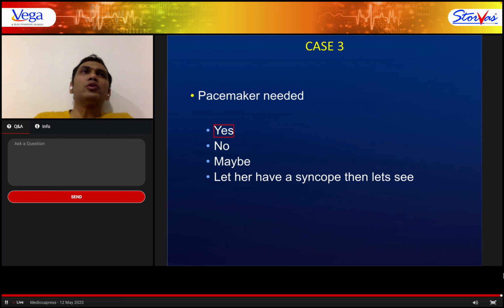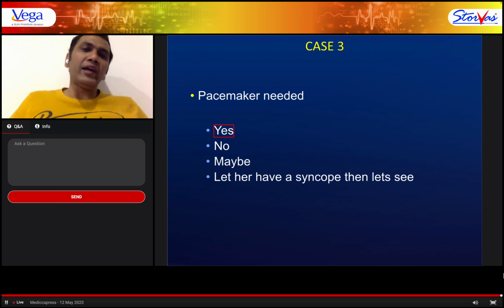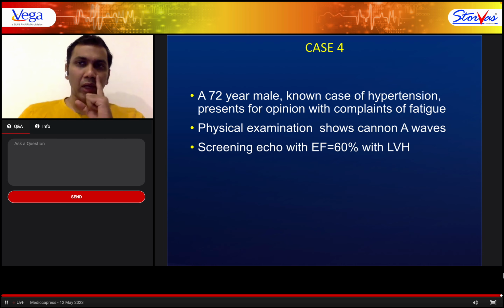See the difference in the two ECGs that I showed. One had a PR interval that was changing with a fixed P wave morphology arising from the sinus node. Whereas in this case, although the P wave was arising from the sinus node, the PR interval remained fixed before the dropping of the P wave conducting to the ventricle, suggesting a Mobitz type 2, second degree AV block.